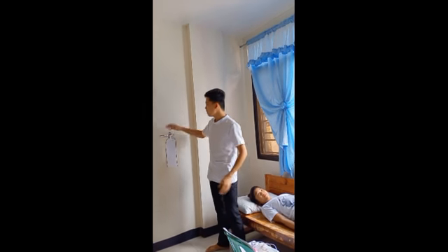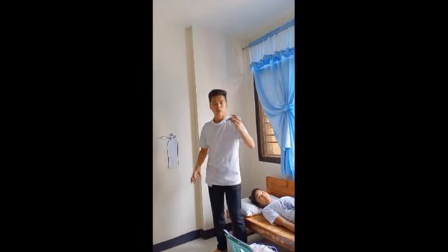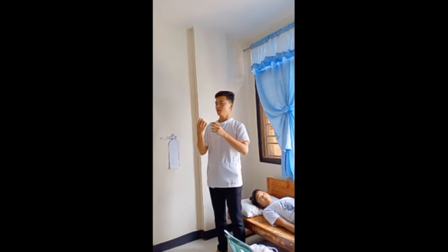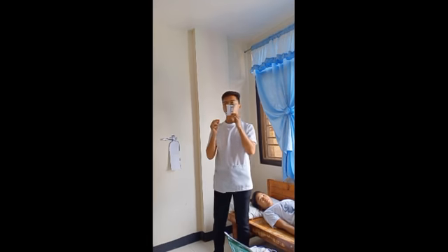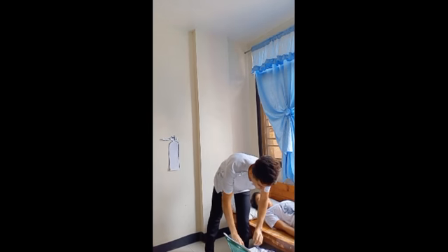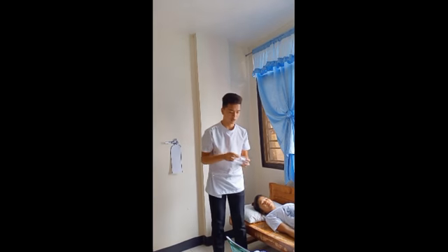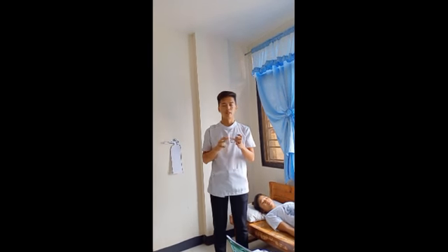Okay, this is the oxygen equipment that we need, and this is the humidifier bottle. Let's assume that I don't have a humidifier bottle, but I have a prepared cup here.